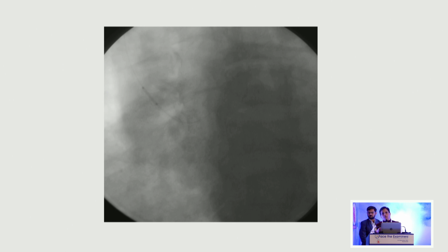that I pulled out the diagnostic catheter with an extension wire of the normal guide wire, because I had a normal length guide wire that was 175 centimeters. That's the reason I asked you. You must be aware of the sizes of the guide wires. So it was 175, but I had an extension, so I could extend it with another connector BMW wire, and then made it 300 centimeters. We removed the diagnostic catheter completely, and took the stent on the wire.